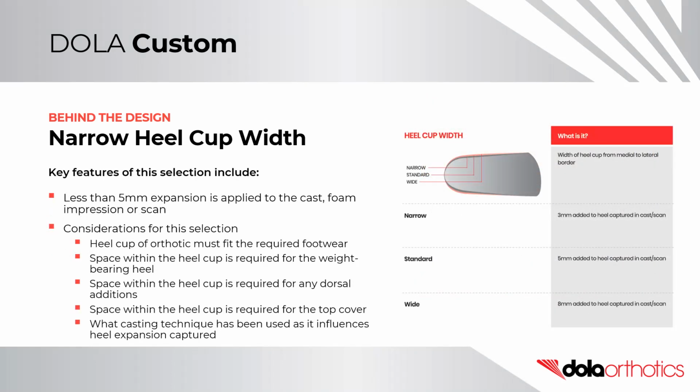Key features and considerations for this selection include that less than 5 mm of expansion is applied to the cast, foam impression, or scan provided of the patient.